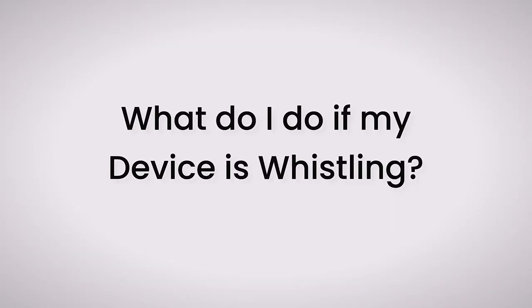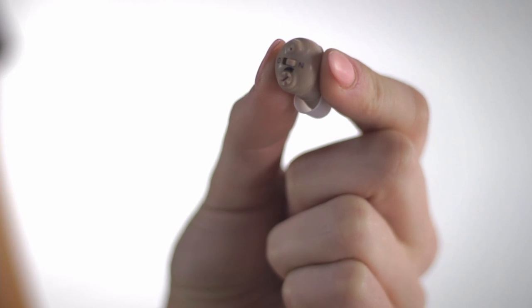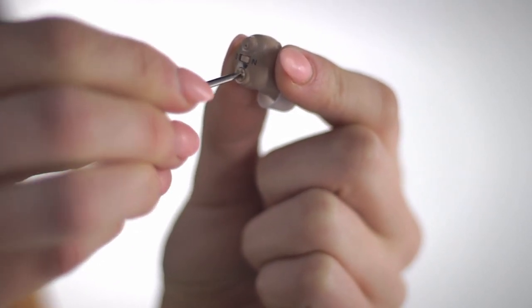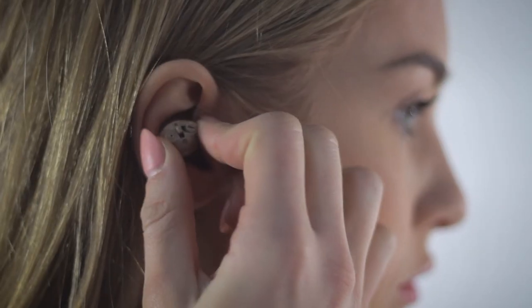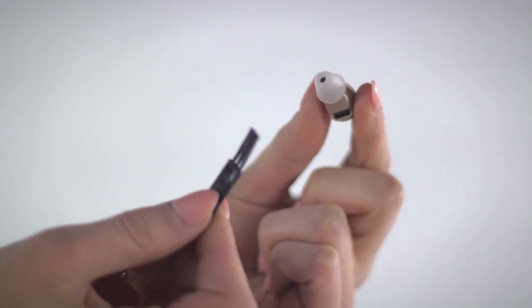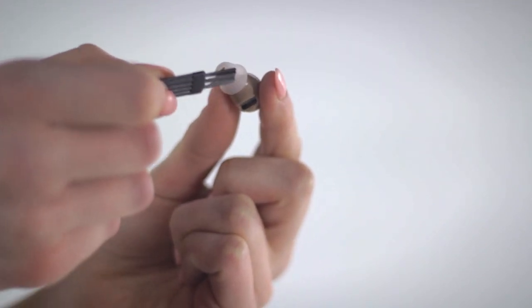Why is my hearing device whistling? The volume setting on the hearing device may be too high. The earplug is pressed too tightly against the microphone. Or excess earwax needs to be cleaned from the device.